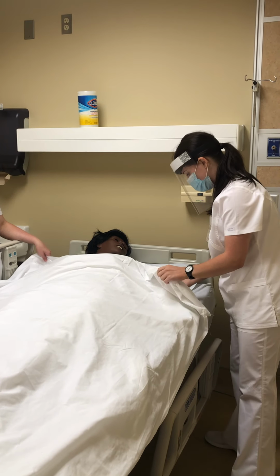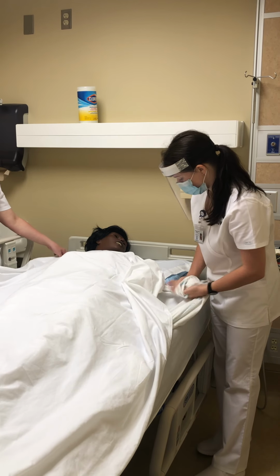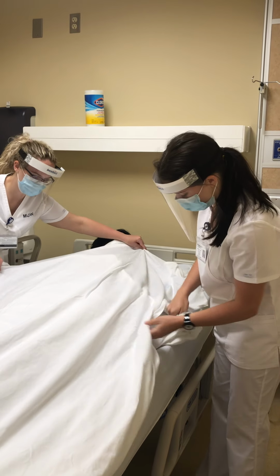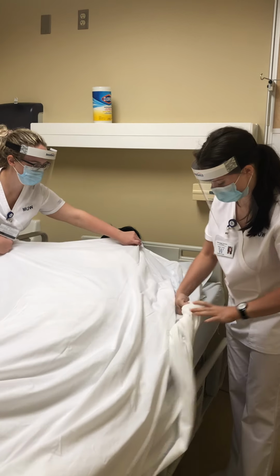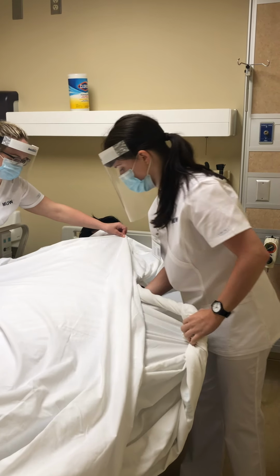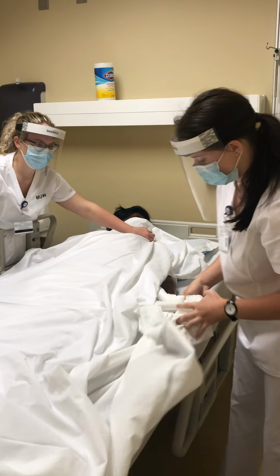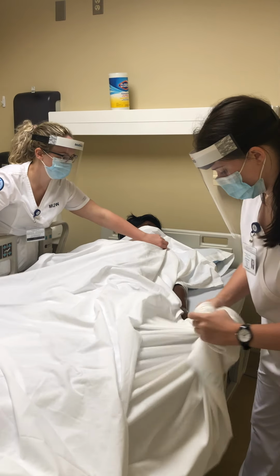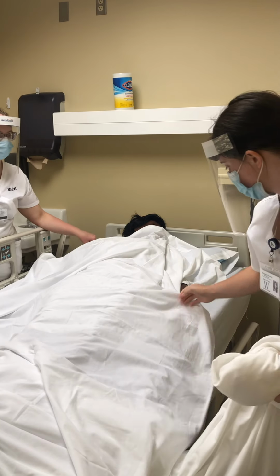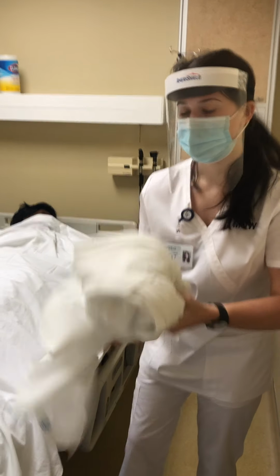Then I'm going to begin pulling the old bed linen out from under her, keeping her privacy intact as much as possible. Again, not touching your scrubs or waving it throughout the air so you don't cross-contaminate anything.